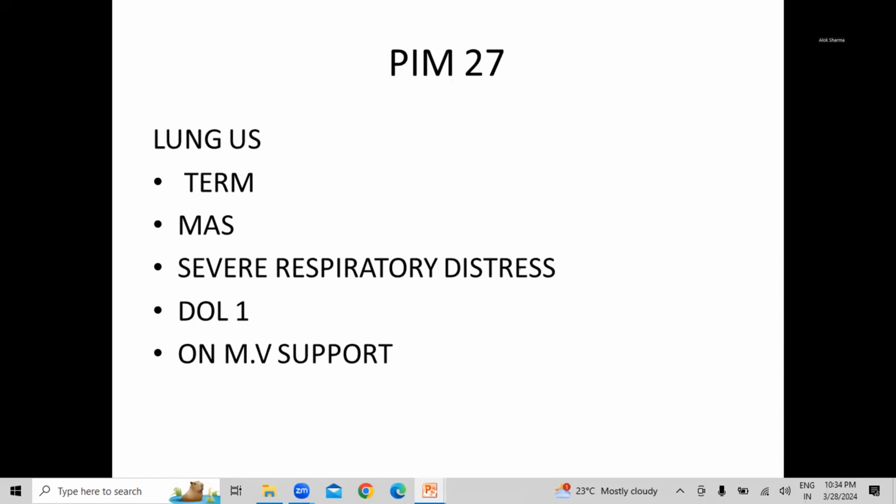If you have a Sonosite, you should be able to do it. If you have a GE, you should be able to do it. I'm not entirely sure whether the Philips lets you do that. Please carry on, Dr. Surjit.